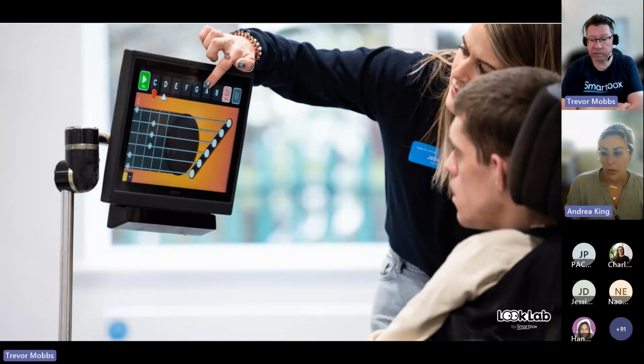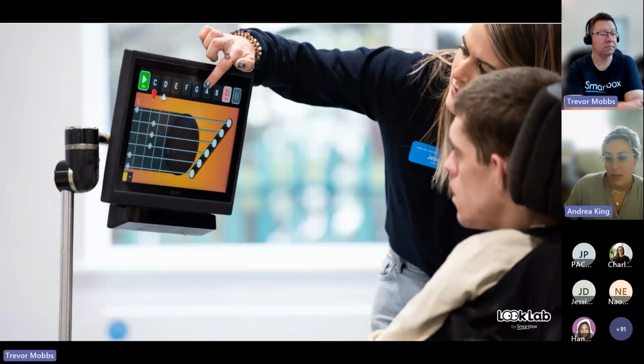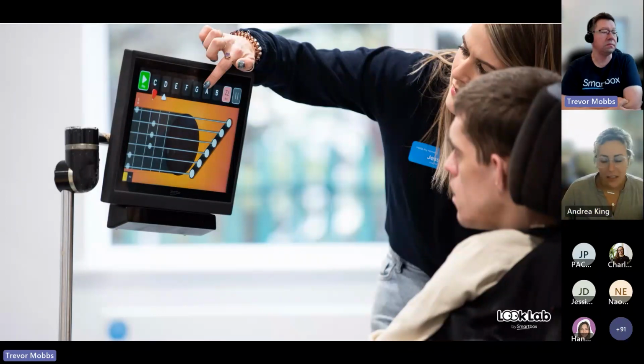So really, what we're looking at mostly is one of those ways, which is eye gaze. And some can even use a combination as well. So eye gaze might be the only way that someone can access a device though, which is fantastic, but that can also take a lot of time to get used to. Users may need and want to introduce that new access method in a different way versus just jumping right into the communication grid sets. There's a lot more complex interfaces as well, in addition to communication grid sets, like our accessible apps, computer control grid set, and things like that.